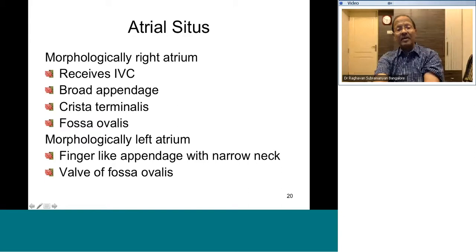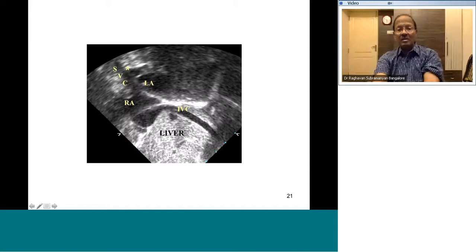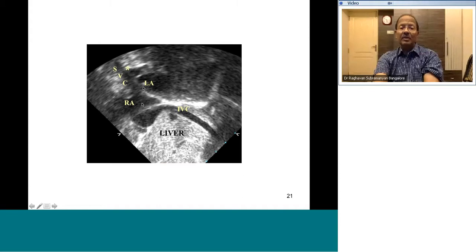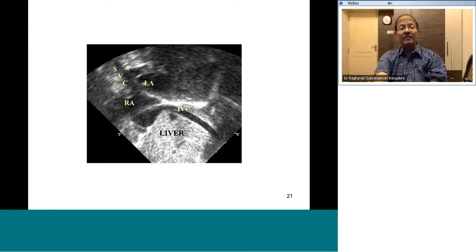On subcostal echo, trace the long axis of the IVC upward to an atrium — that is invariably the right atrium. In this view you can also see the broad right atrial appendage and, with appropriate angulation, the SVC joining. Therefore there is no doubt that the chamber receiving both SVC and IVC with this appendage is the right atrium; by exclusion, the other chamber is the left atrium. Most commonly the pulmonary veins return to the left atrium, so identifying pulmonary veins and the narrow finger-like left atrial appendage confirms the left atrium.